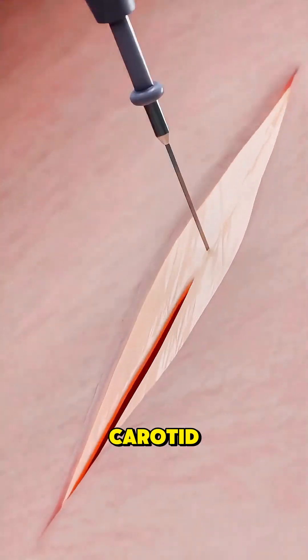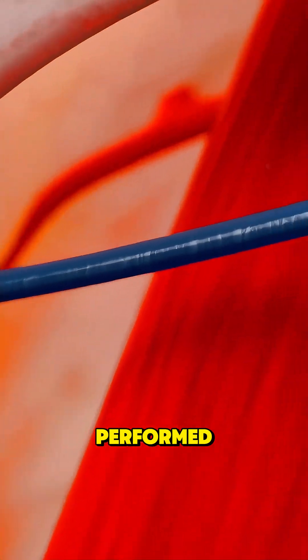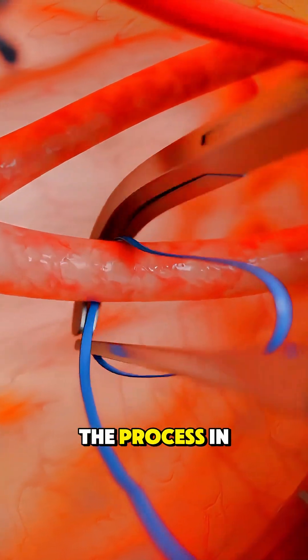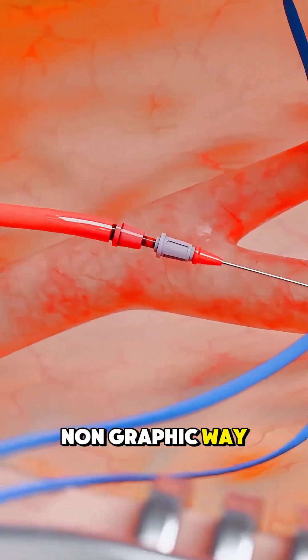Ever wonder how carotid endarterectomy surgery is performed? In this quick breakdown, let's walk through the process in a simple, non-graphic way.